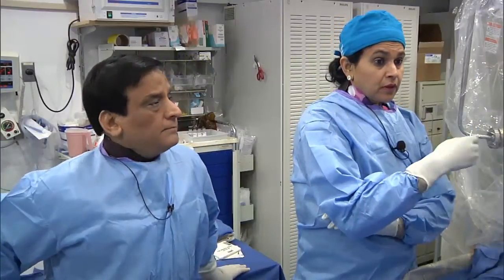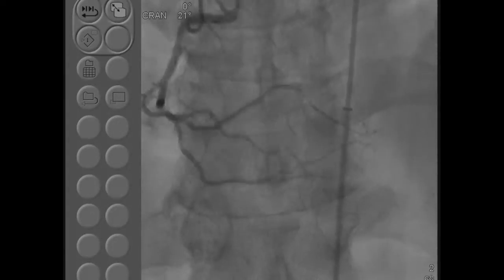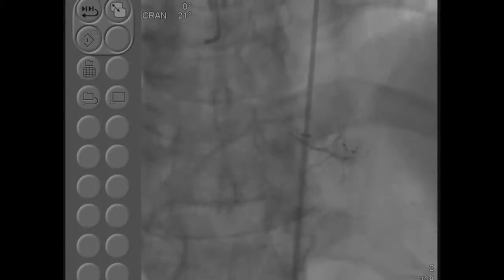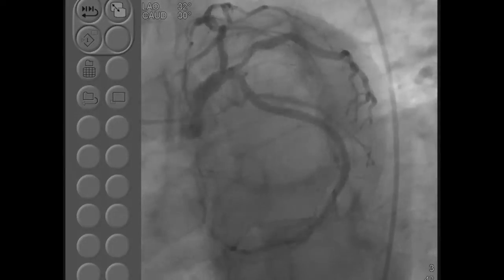Show the angiogram now. So, normal LV function, some mild apical hypokinesis. This is the right coronary artery, which is a codominant system. If you see, some moderate diffuse disease of the moderate size RCA. You have one septal, you can see some filling of the LAD, but essentially this is what you see. Left main is okay. Moderate 50% disease of that large ramus.